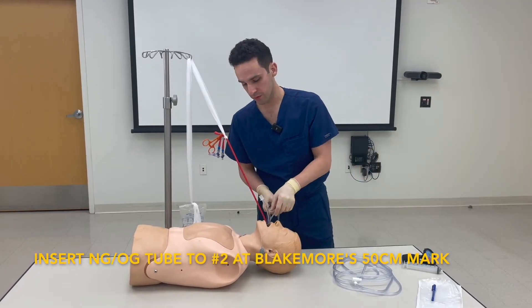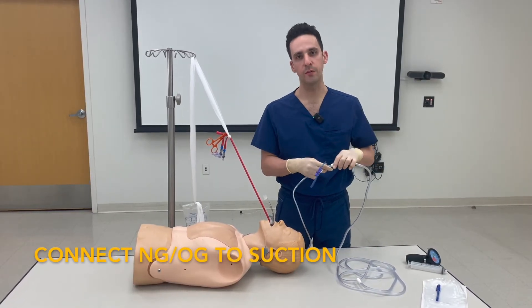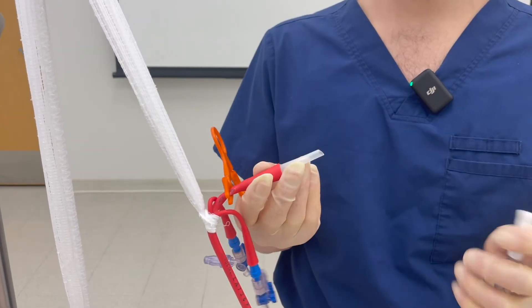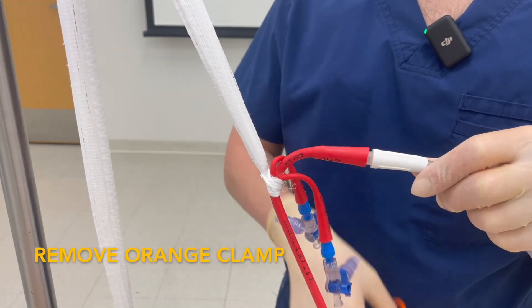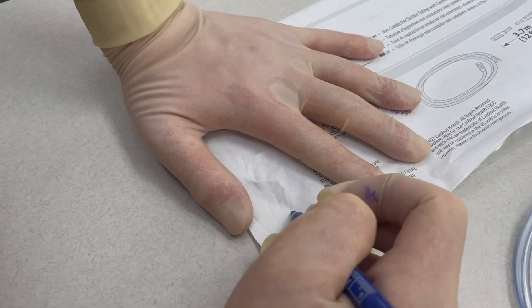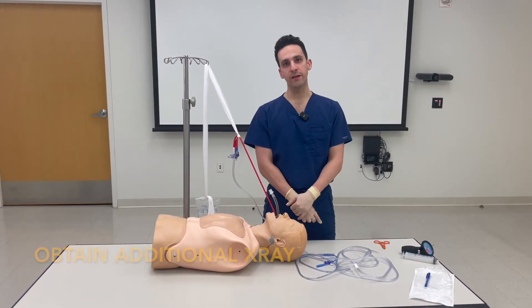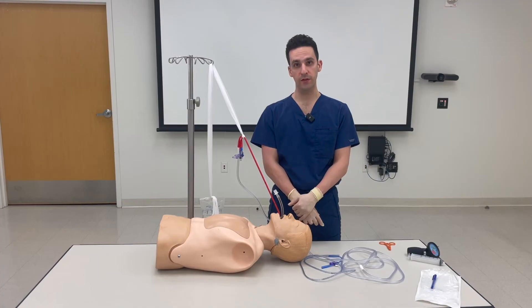Insert the gastric tube to number two so it lines up with the 50 centimeter mark. Connect it to suction and ensure hemostasis. Remove the gastric tube. Take your suction and the football connector and connect it to your central aspiration port. Remove the orange clamp and aspirate the contents of the stomach. Write down the time of the esophageal balloon inflation. Call GI. If you have not achieved hemostasis, consider calling surgery or IR. It's a good idea to obtain an additional x-ray to confirm placement of the Blakemore tube, but also to confirm that your ET tube is still in appropriate position as it may have shifted during placement.